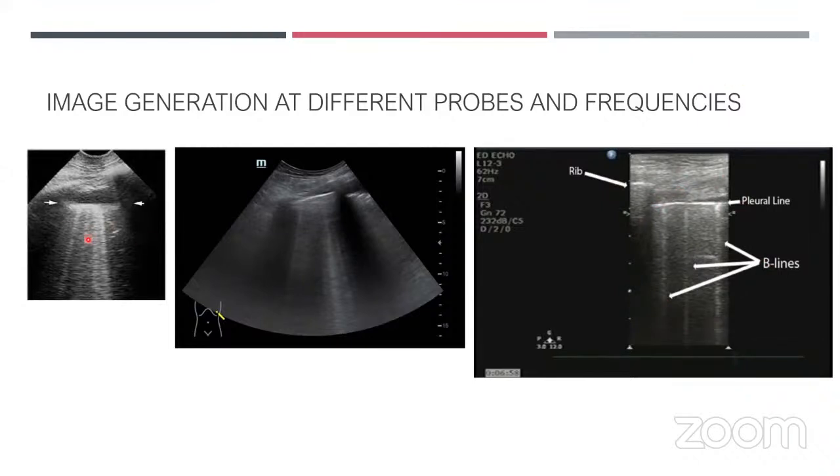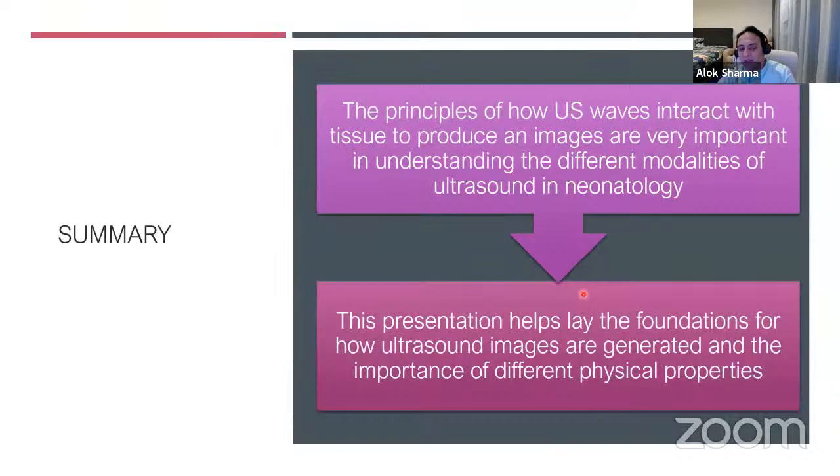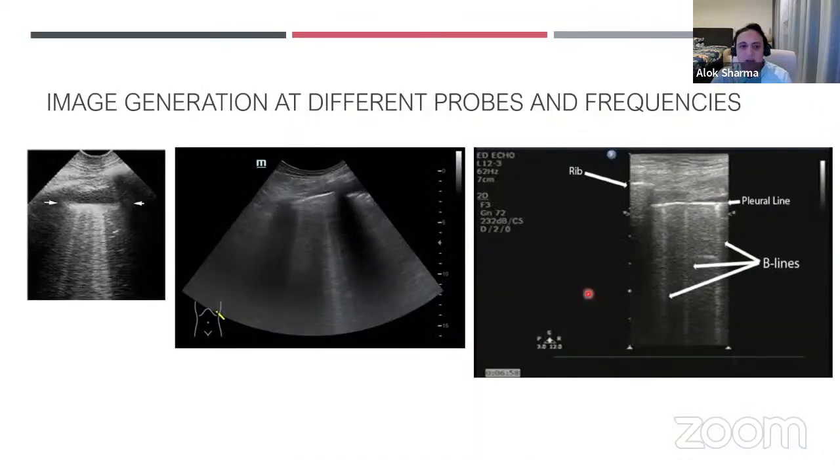But if you use a sector probe, what you're going to end up with is a picture like this. And they look quite diametrically different, though the interpretation, if you clinically correlate, might be quite similar. So just be aware of these differences. I'm going to finish by saying that we will revise this again. This is not an easy concept, but I will be sending you around some videos.